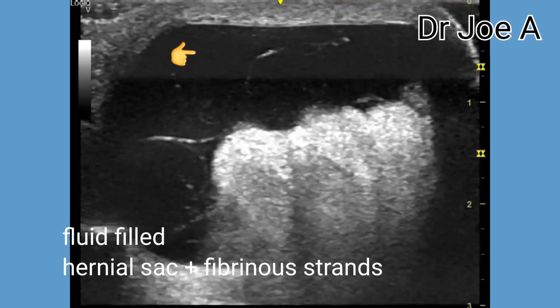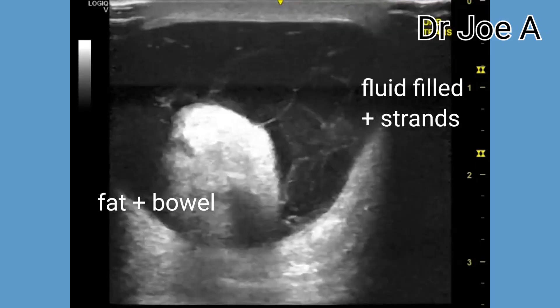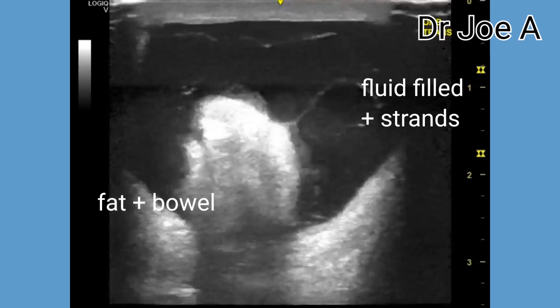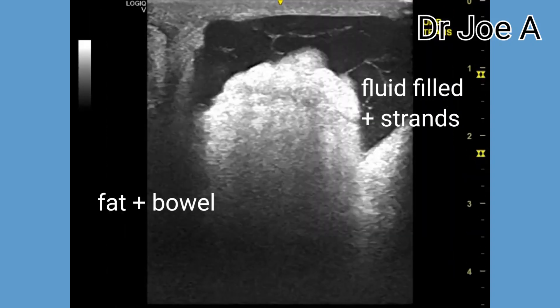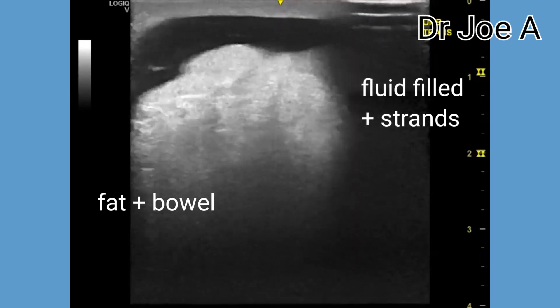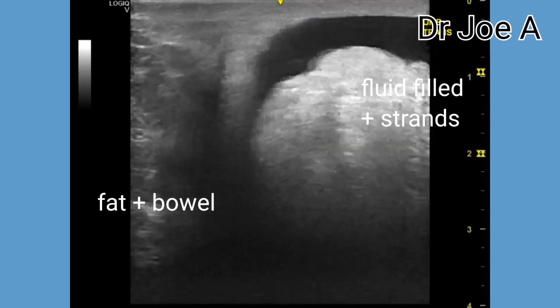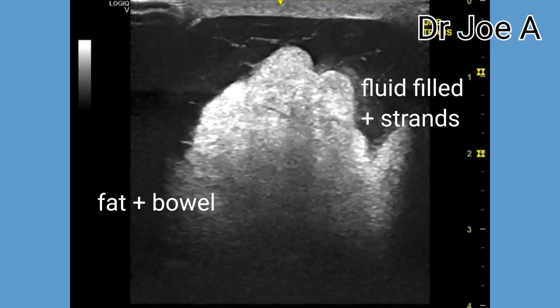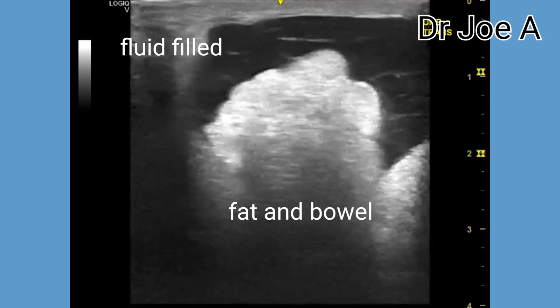Adults with umbilical hernias may experience pain, discomfort, or a visible bulge in the area around the umbilicus. In this patient, the umbilical hernia contains fluid with fibrinous strands and mesenteric fat as well as small bowel loops. The mesenteric fat and fibrinous strands are seen within the hernial sac.